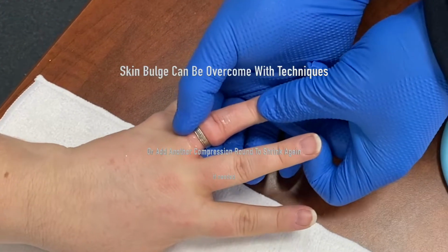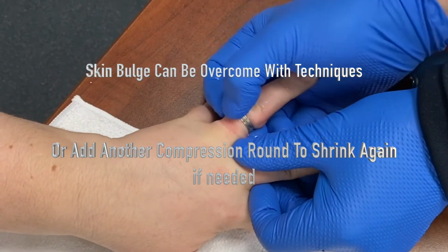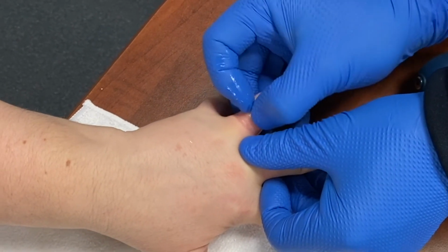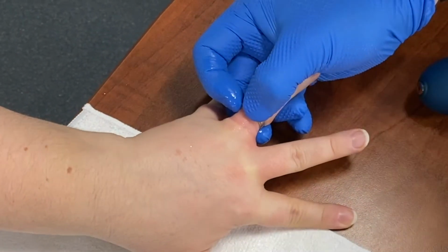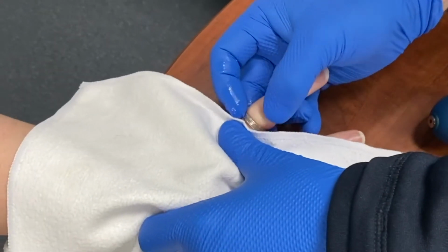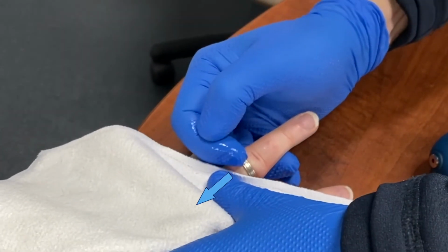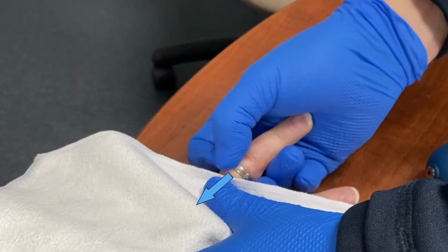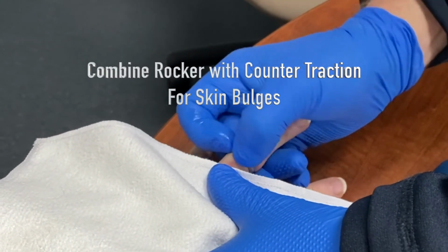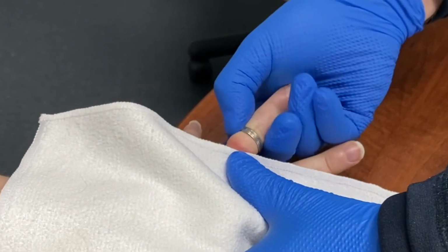I might have to put another round of compression on there, but we'll just start walking this one forward too, okay? And keep walking this one forward. Now this one here, I'm going to put a little bit of counter traction. I'm just going to move this out of the way, and I'm going to take this towel here. Let's try and pull that skin underneath a little bit, because here we're bunching up. So a little bit of what we call counter traction allows us to slip the skin under, and then a little bit of corkscrew combined with a little bit of counter traction. Keep walking it off. Slow and steady.